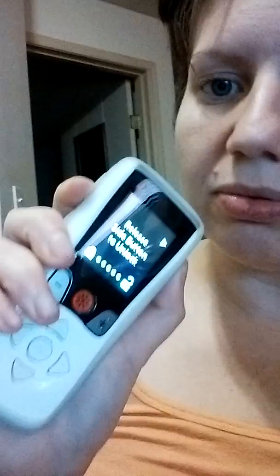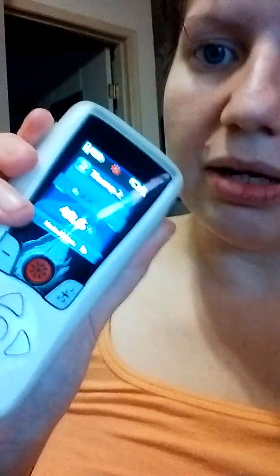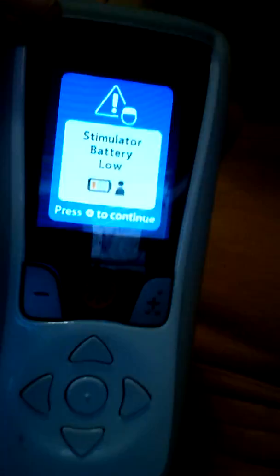Oh, so this is the remote control. I have the same remote. They have a different model that's like the crème de la crème of remotes, but I really don't need that right now. I'm still trying to figure things out as far as what settings work best for me and what pulses and what hurts and all that jazz. It's all a learning process and learning curve and trial and error. The remote tells you when you're running low. Like right now, my battery needs to be charged, and it lets you know to charge the battery.